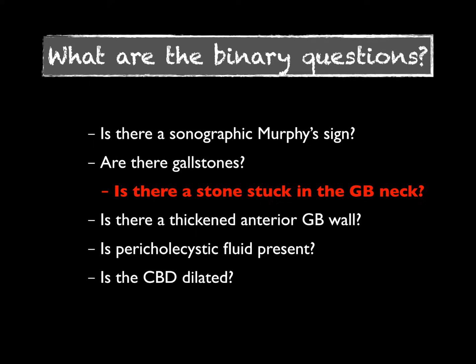Remember that ultrasound is not the ultimate diagnosis of cholecystitis, but it is a data point or provides information that can support a diagnosis of cholecystitis. However, it is a clinical diagnosis, but we can use some of these sonographic findings to help us diagnose it. So what we're going to look at is the binary questions.